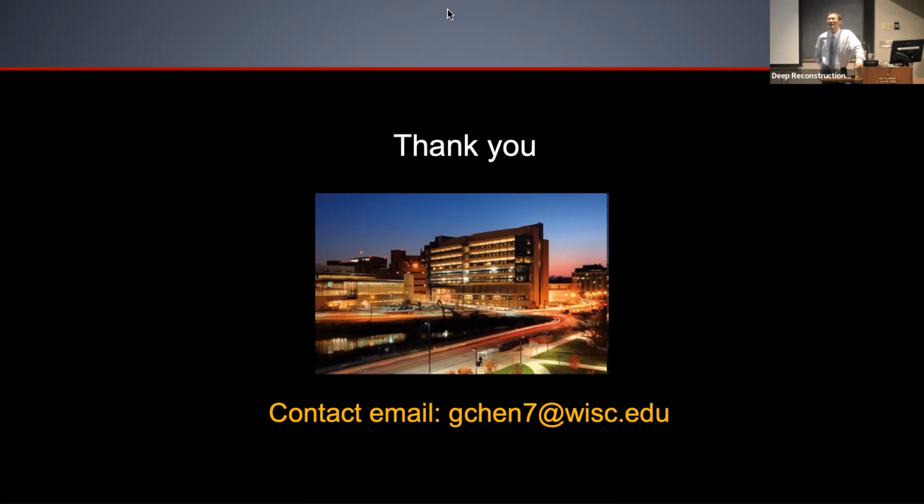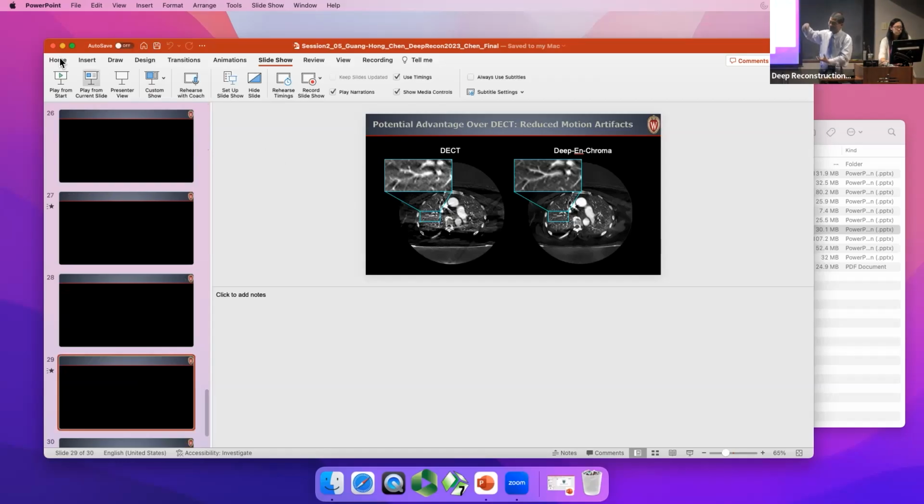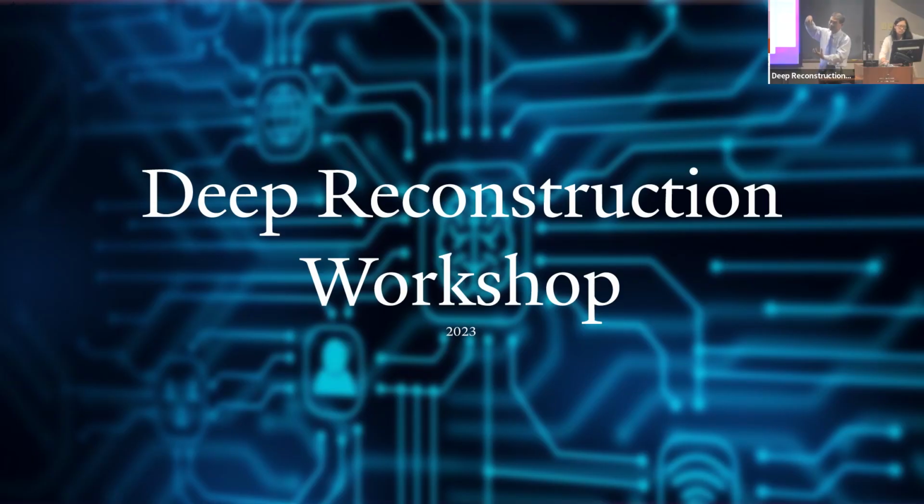Remember, GE makes scanners, Siemens makes scanners differently. From two material bases, just like our body composition being sent into the scanner, the scanner actually contaminates the data with all the electronics and the physics. So if you just do a simple combination, you use an idealized model to generate sinograms, so you always have error. That is why we need a fully physics-based scanner model to simulate all the physics the data goes through. Okay, make sense? Great.